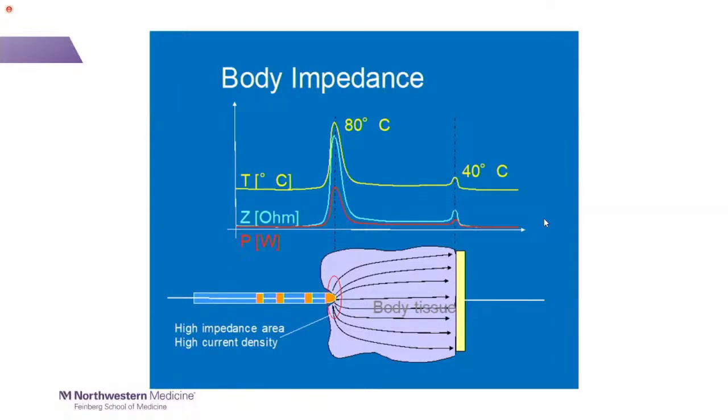If you measure body temperature, so this is our person and the ablation electrode, if you measure body temperature at the ablation tip, it's very high. At the dispersive electrode, where all the electrons are flowing and you're generating some current here, it also comes up a little bit, okay? It's a little warm, but because there's not high current density, it's low current density, right? Because you have a large electrode through which you're dispersing that, the temperature is relatively low.